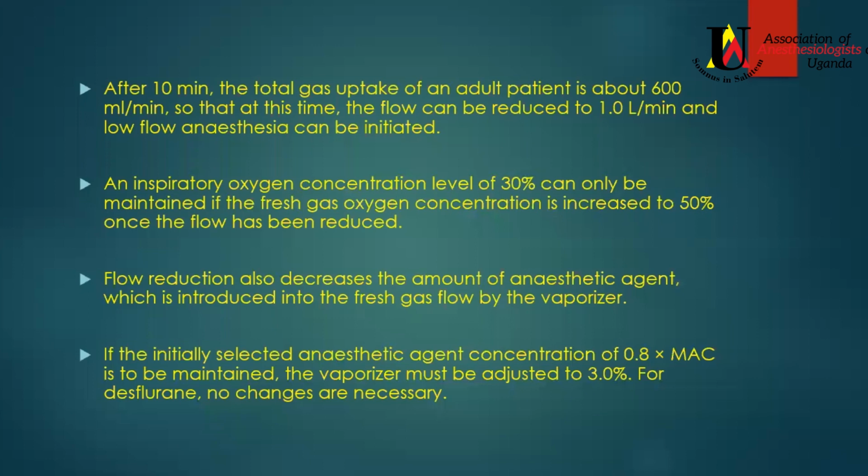Because you are running nitrous, and remember we said there's a risk of hypercarbia and hypoxia with low flow. When you are running oxygen alone, we said you can set your FiO2 between 28 to 30%, but here with nitrous oxide, you want to increase your FiO2 to around 50%, just in case there is any disconnection or a leak. You're having at least 50% oxygen, which can help you offset all these hypoxic effects. You don't want to be running 30% where the patient can suffer deleterious effects from hypoxia.